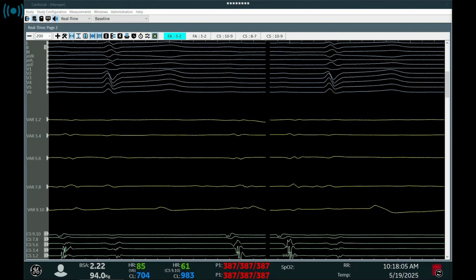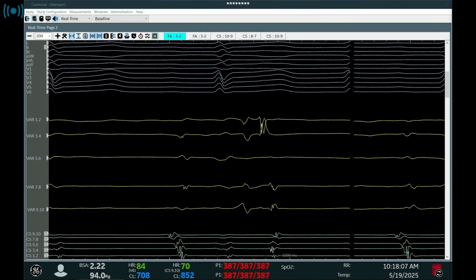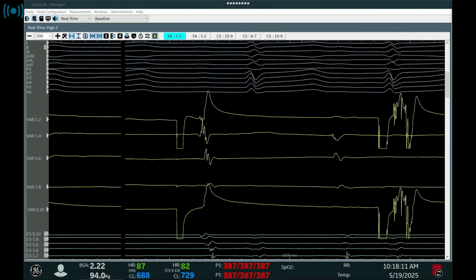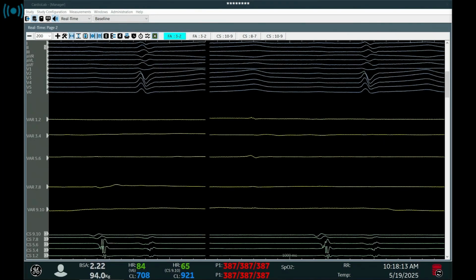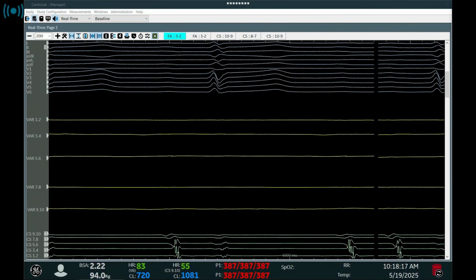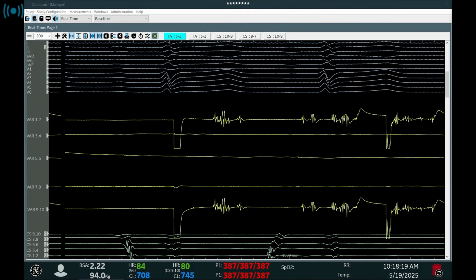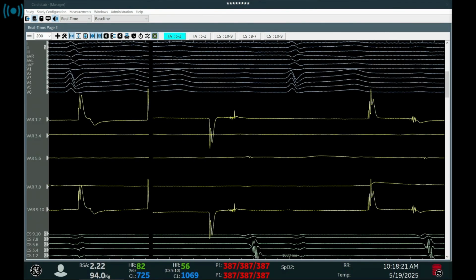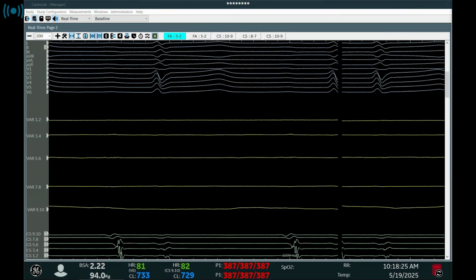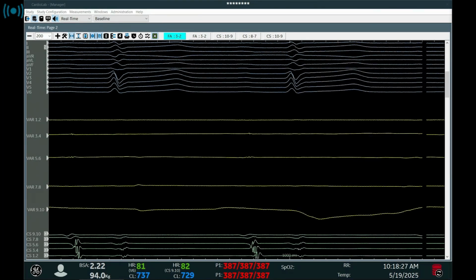Okay, perfect. Now I move to the right pulmonary vein. Please keep the left side on the anteroposterior always. Okay, thank you. This is the right superior. There's nothing. It's clear. I go to the antrum because, of course, we did the antrum as well. I open and it's clear also the antrum.